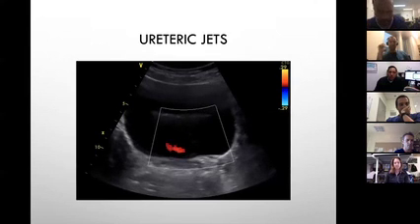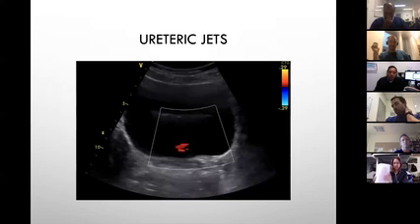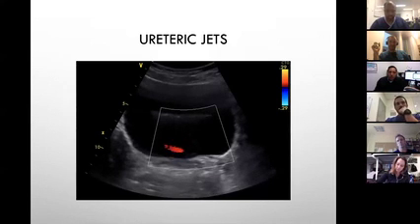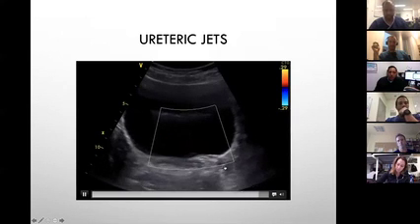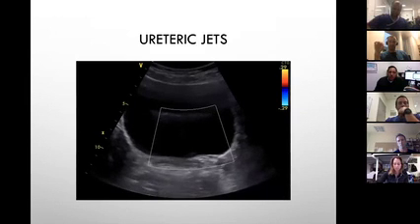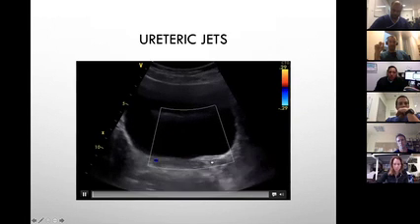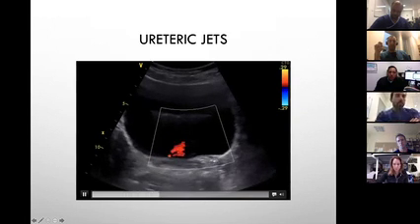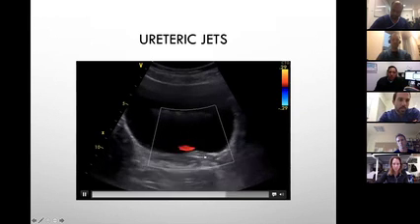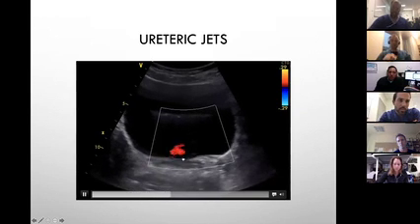I think I need to move a bit faster. You've got some ureteric jets here. Where do you look? The VUJ. How do you find the VUJ? You go to a transverse view on the bladder and fan through the bladder until you see a small bump, two bumps coming up. That's the VUJ. Sometimes you can see the ureter as a hypoechoic line coming in at an oblique angle. It just enters the bladder.